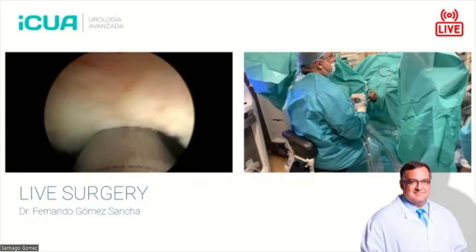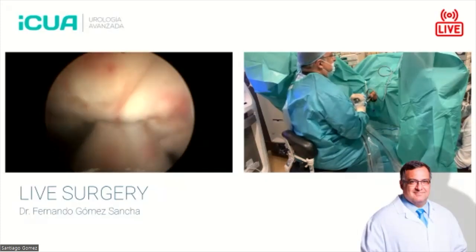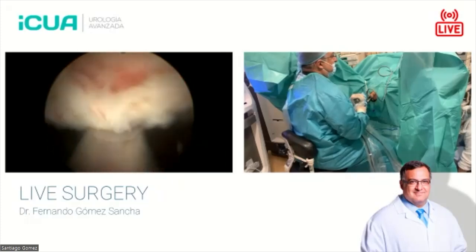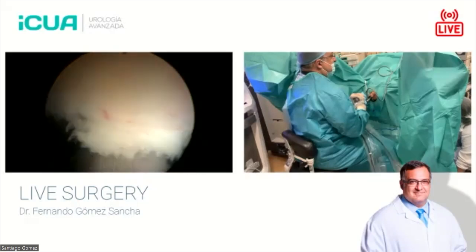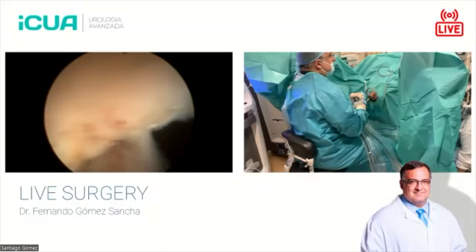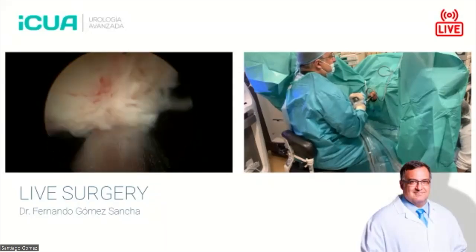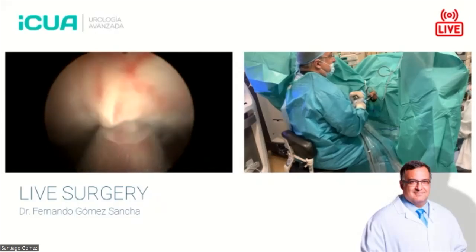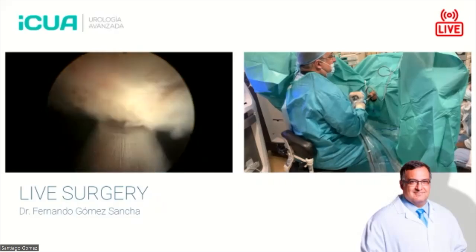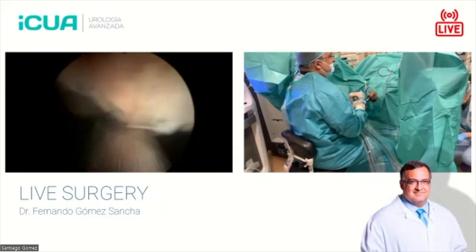understanding, as I said, tissue effects, laser tissue interaction, and how to use the laser fiber properly. The settings are important, but to a certain point, because two surgeons with the same settings will produce different tissue effects. One surgeon could be very safe, and another surgeon could be very reckless, if he doesn't understand how tissue laser interaction works.